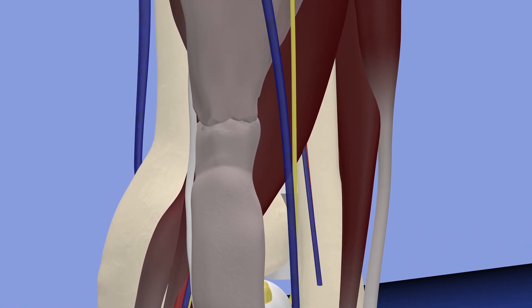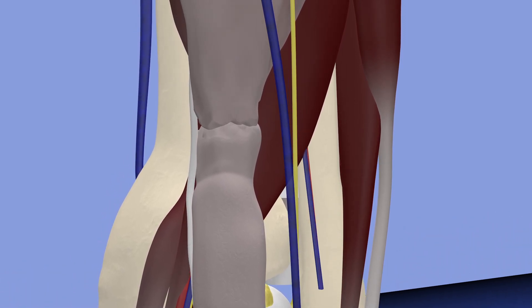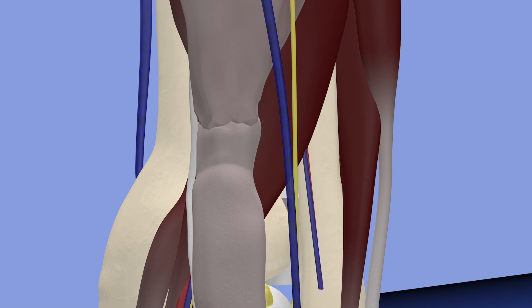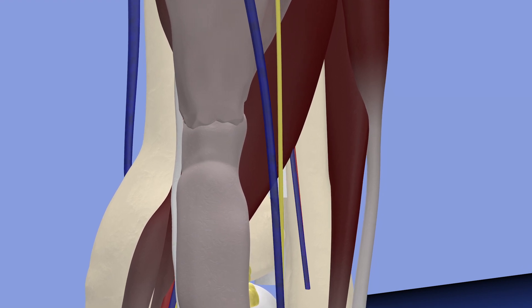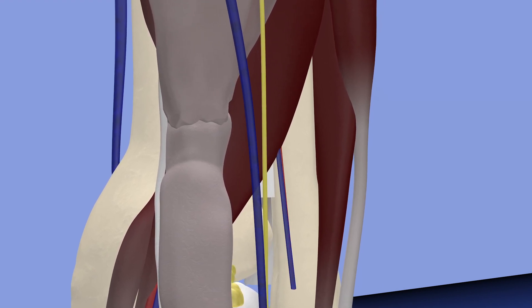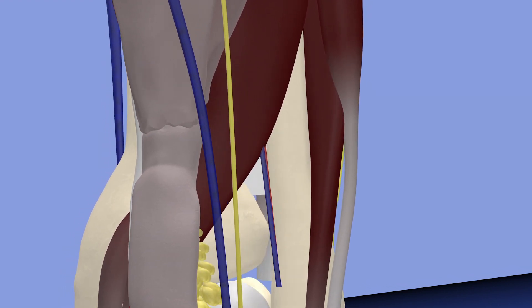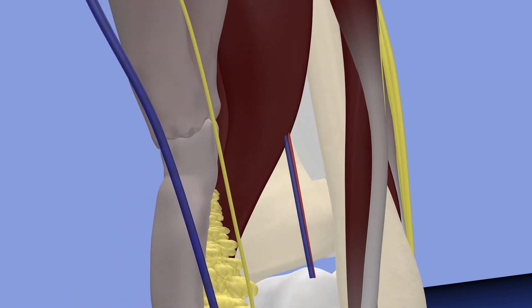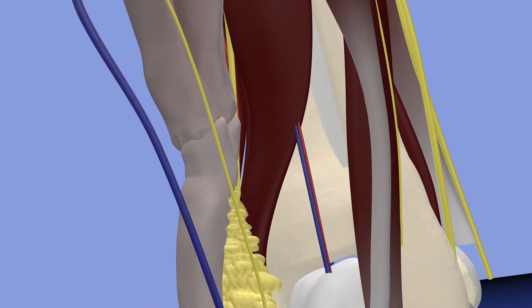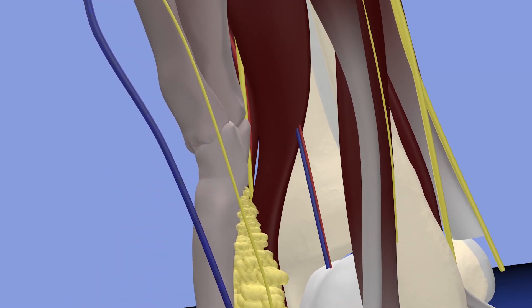With dorsiflexion the ends become further apart, and then with passive plantar flexion they essentially approximate each other. Here again is a lateral view of this injury as well.